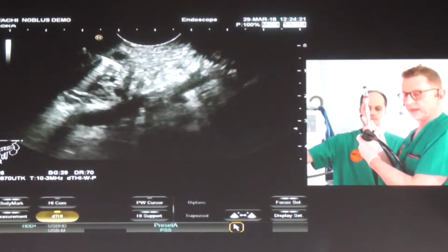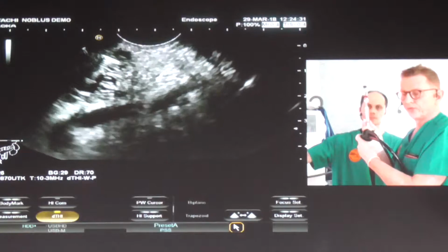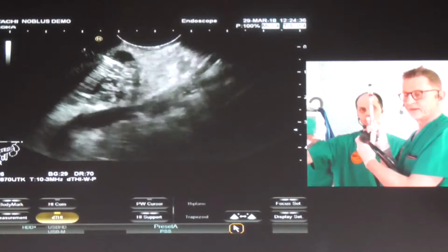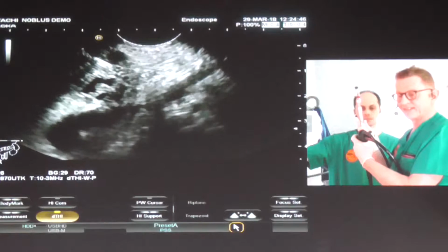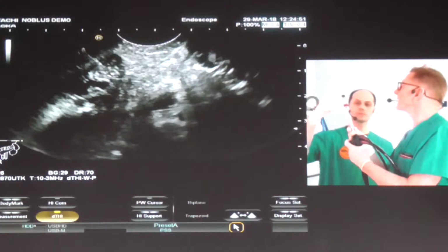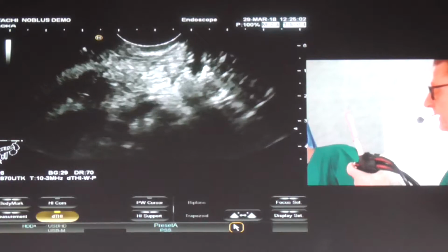Therefore, we always give antibiotics. We usually give cephalosporin, Cinacef, 1.5 gram of that. So I move the needle now back and forth. You know, I think if we can get histology or cytology out that for sure demonstrates this is a serous cystadenoma, I think this would be of benefit and also make a decision not to do any surgery. I think that's fine now. We also have some material in this, as you can see, it's pretty bloody. Now I retract the needle, lock the piston, and unscrew this one.